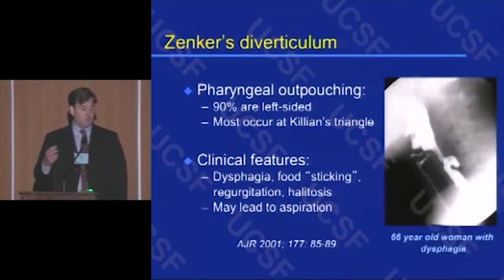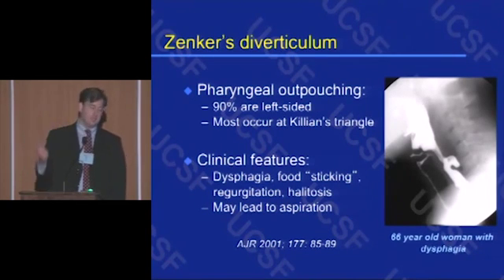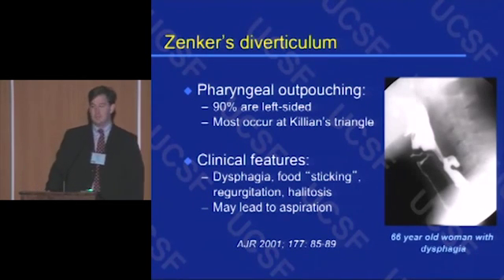And it's important when you're doing the esophagram that you watch the bolus clear from the Zenker's, because sometimes they'll be asymptomatic and the bolus, the fluid, the barium, will actually get pulsed up, and you'll see aspiration towards the end of the examination.